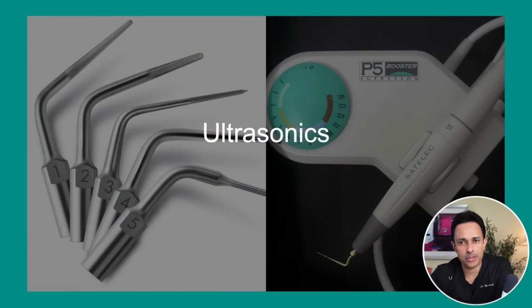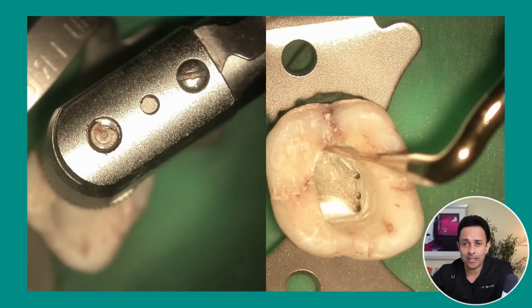The third tool is, of course, ultrasonics. A lot of people use ultrasonics itself for removing dentin, but I usually like to use a burr. What is the advantage of using ultrasonics? It's very simple. The main advantage is the access.